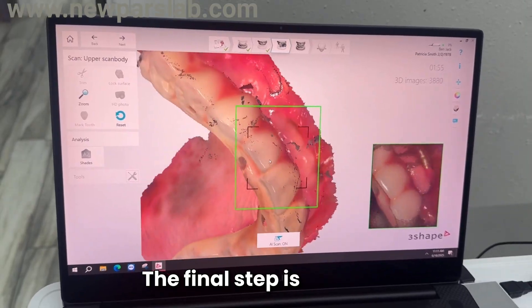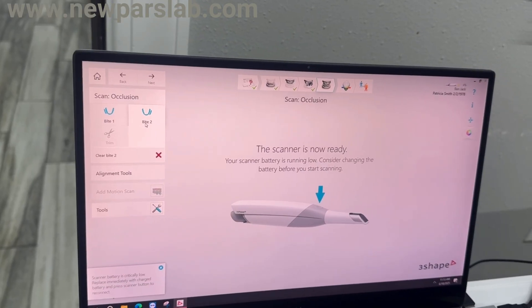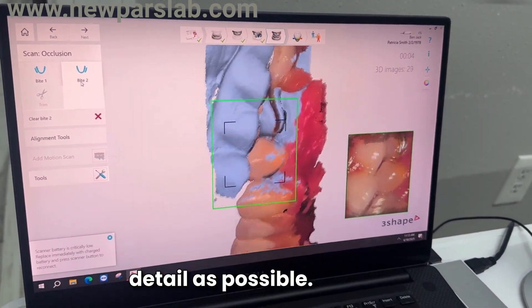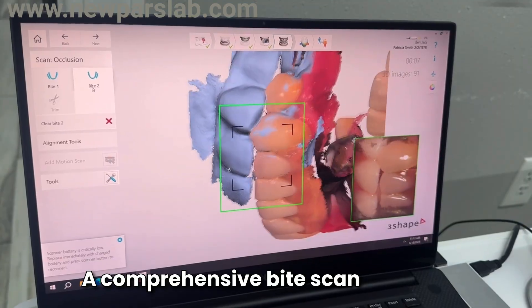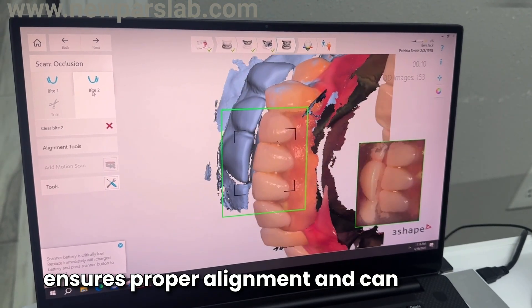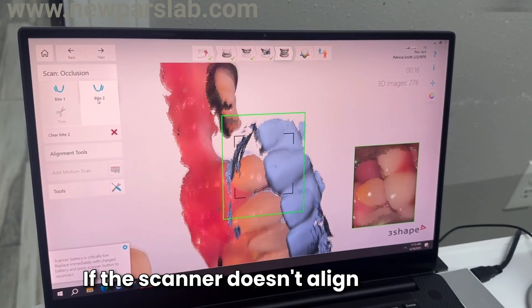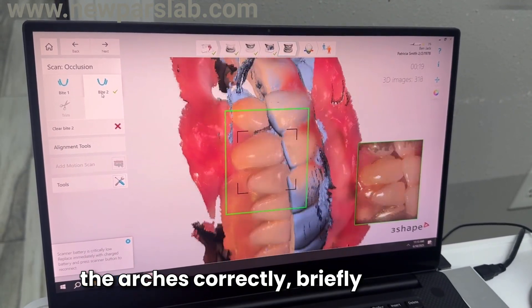The final step is to scan the occlusion. When doing this, make sure to capture as much surface detail as possible. A comprehensive bite scan ensures proper alignment and can serve as a valuable reference during the design phase if the scanner doesn't align the arches correctly.